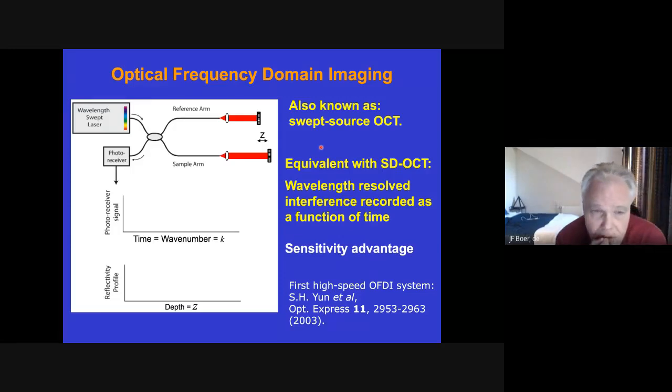Okay, so the idea is that if you have a measurement method where you split the wavelengths up in different bands in the detection, you get an incredible increase in sensitivity. Developing an OCT system with a spectrometer worked really well in the near infrared range, let's say 850 nanometers, and that is also the wavelength that was used a lot for ophthalmic imaging.